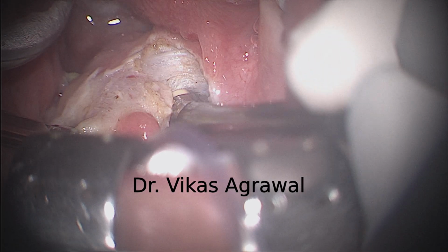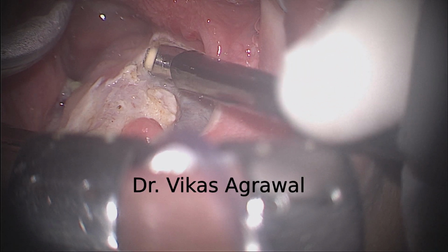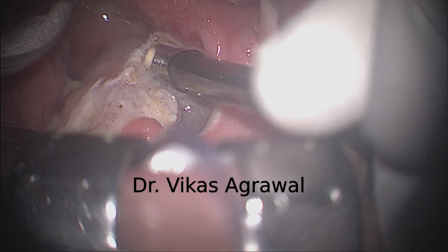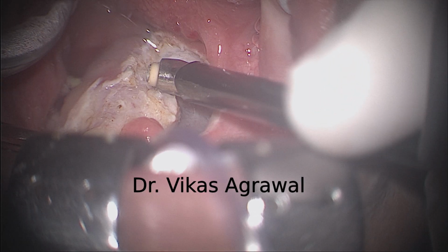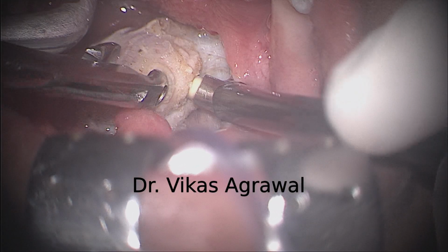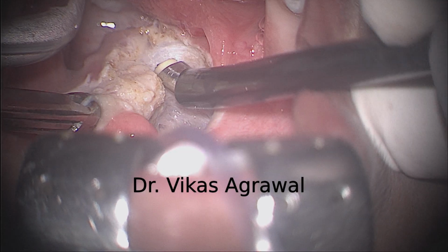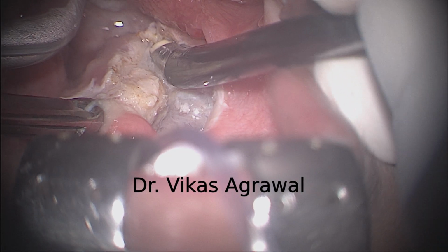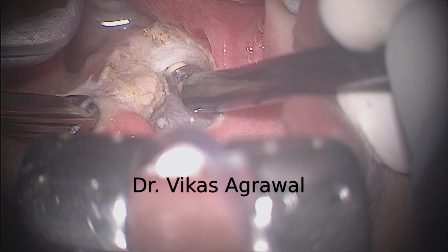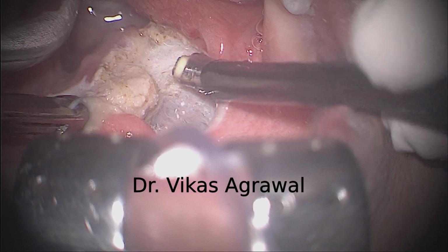So I am coagulating on the course of the tonsillar artery and then dissecting on the medial part so that I do not divide the tonsillar artery in its main course. And the tonsillar artery is already coagulated along the length, so it is unlikely to open up in the post-operative period.